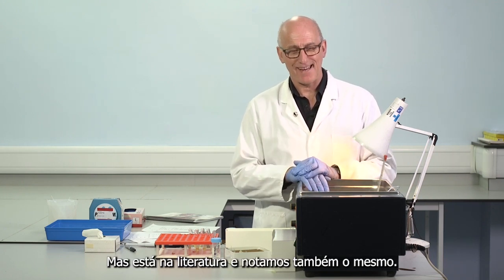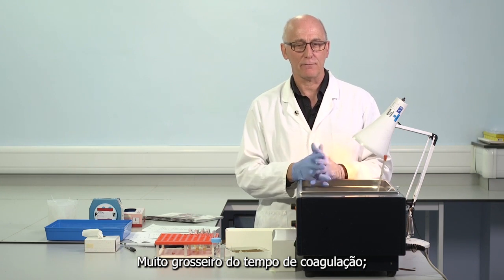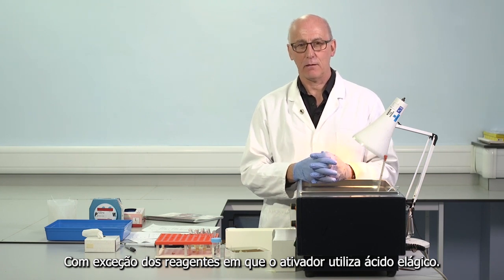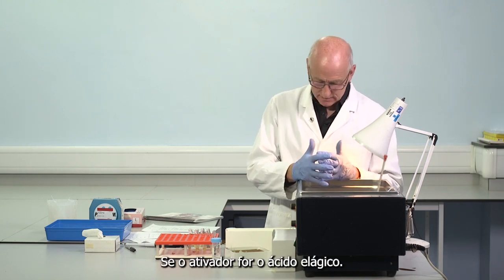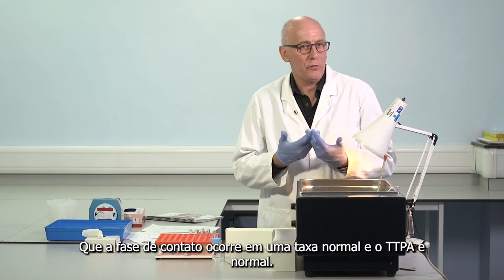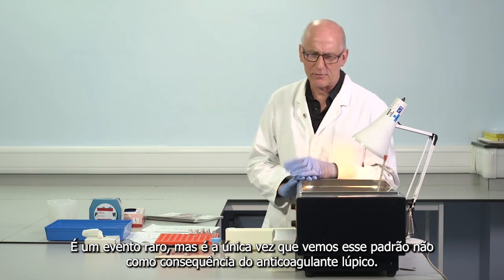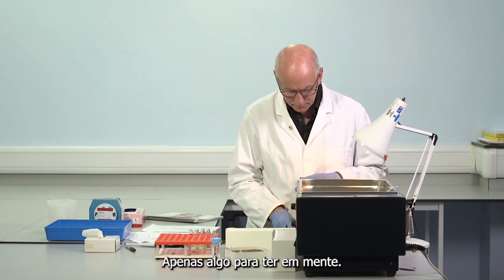So it's a rare event. But it's in the literature, and we noticed also the same. If you make the APTT with most APTT reagents, there is a very gross prolongation of clotting time, 90, 100 seconds maybe, with the exception of reagents in which the activator utilizes ellagic acid. Remember, one of these does. If the activator is ellagic acid, we noticed, and again it's in the literature, that the contact phase runs at a normal rate and the APTT is normal. So we see a gross prolongation with most reagents, but a normal result if the activator is ellagic acid. It's a rare event, but it's the only time we see that pattern not as a consequence of lupus anticoagulant. Just something to keep in mind.